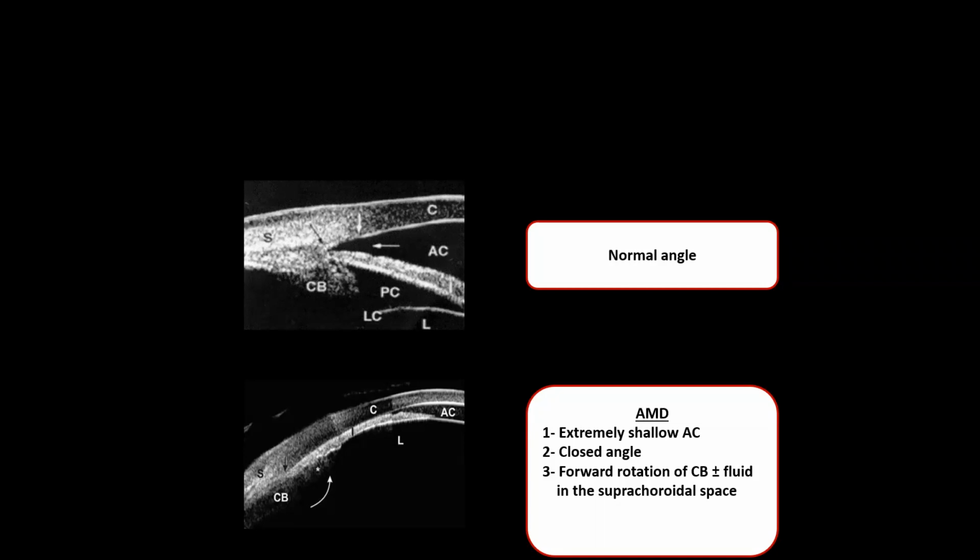Okay, so you will use YAG laser to do posterior capsulotomy and disrupt the anterior vitreous face, right? Why are you doing this? What is your gain? To allow the fluid to be diffused from the posterior to anterior.